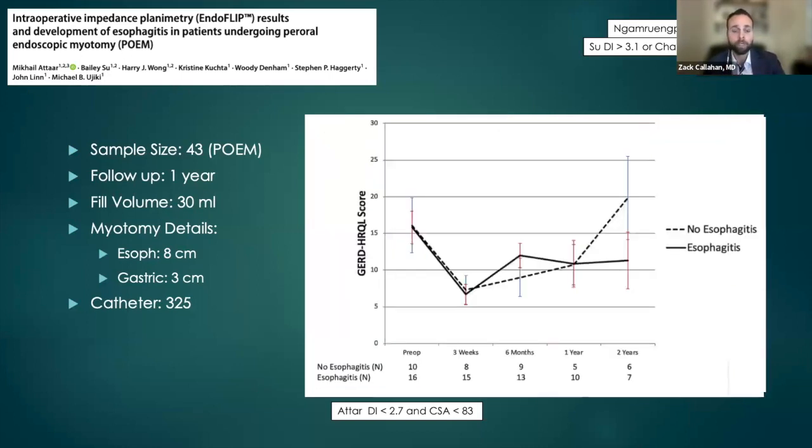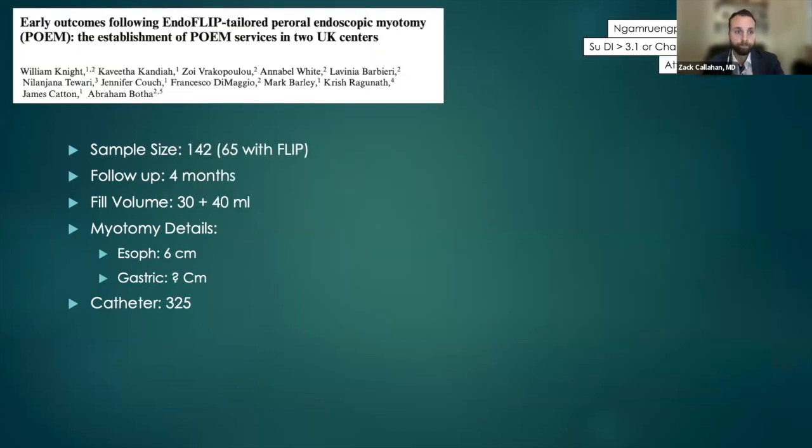Symptomatic GERD was also looked at, and it just kind of reflects this idea of achalasia patients probably having silent reflux because there's no correlation between GERD scoring and their EndoFLIP findings.